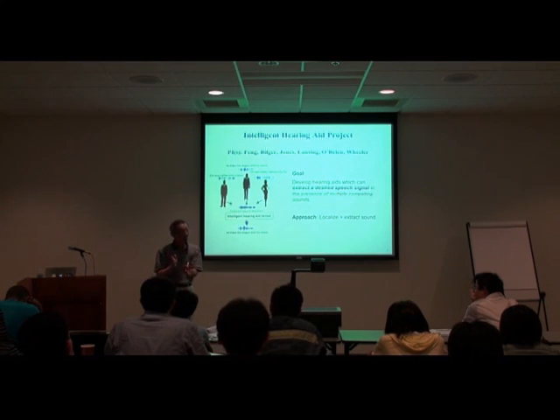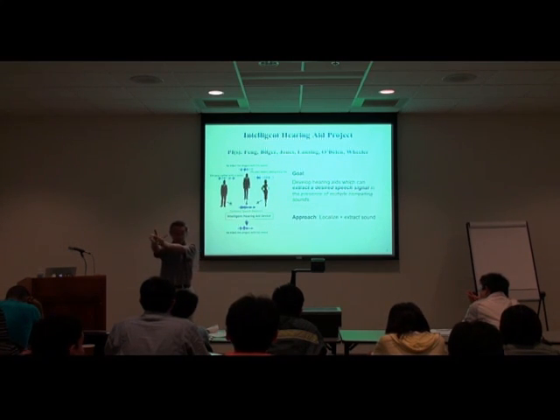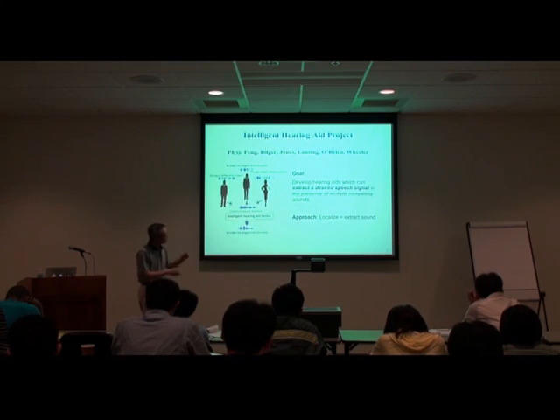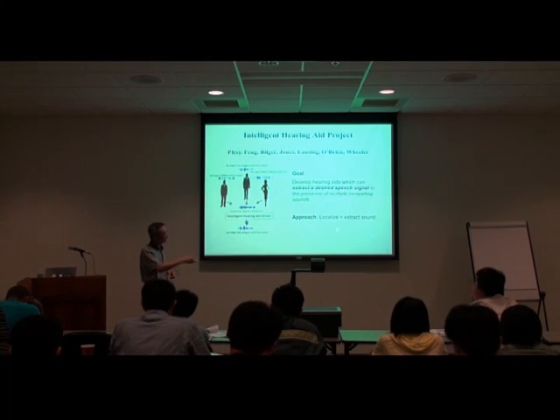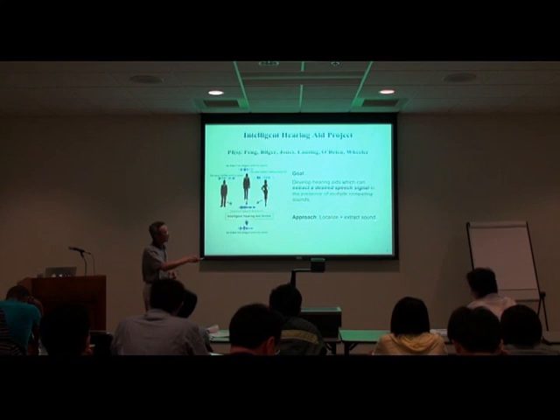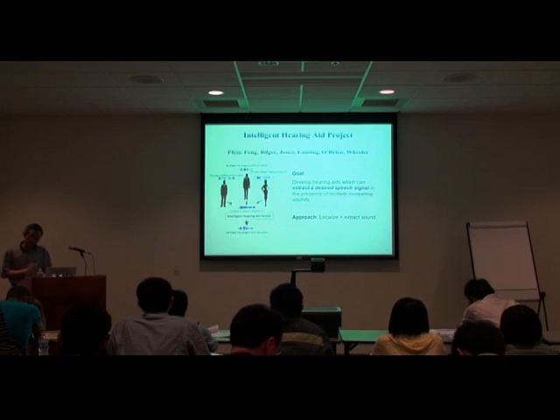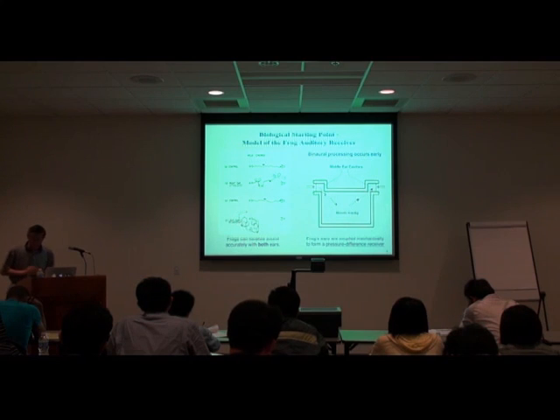Location is the simplest thing. Most individuals do that. We locate, and then we just focus on the sound only from that aspect and drop the rest. So the strategy we decided on is that we localize and then extract the sound from that location, rather than picking up the sound characteristics and extracting that sound.